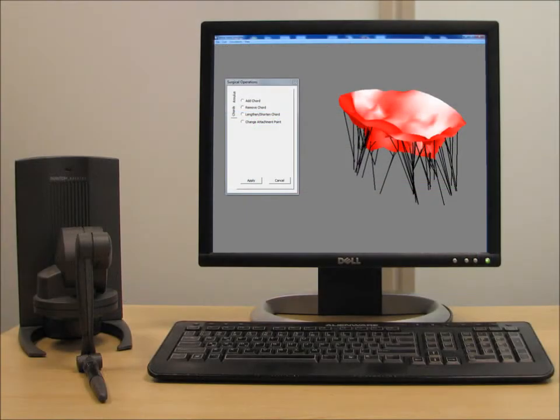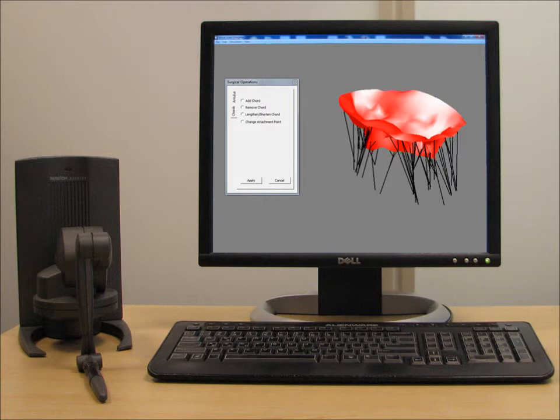Because of the complexities associated with valve repair, significant efforts have been undertaken to better understand valve mechanics. However, previous models have been too computationally intensive to permit real-time user interaction, making the planning of procedures difficult. We have thus developed an interactive, patient-specific valve simulation system to address these insufficiencies.